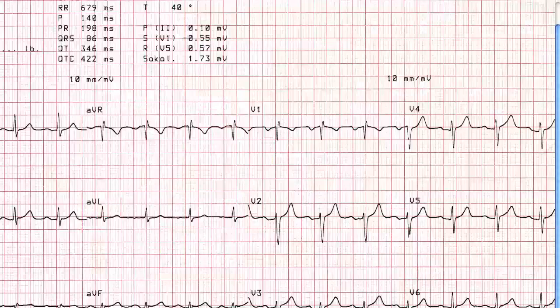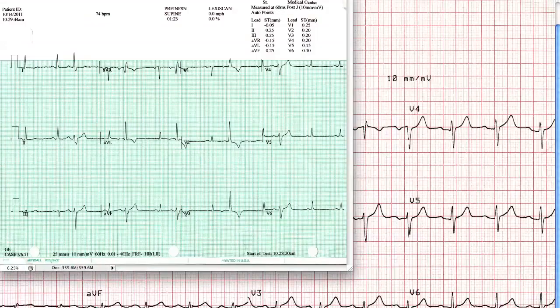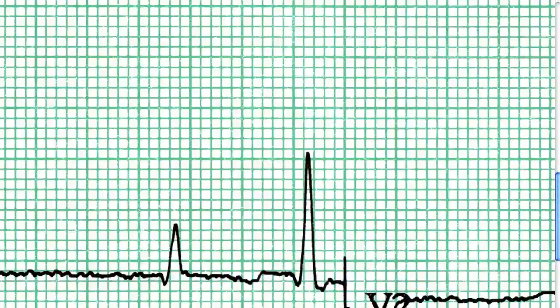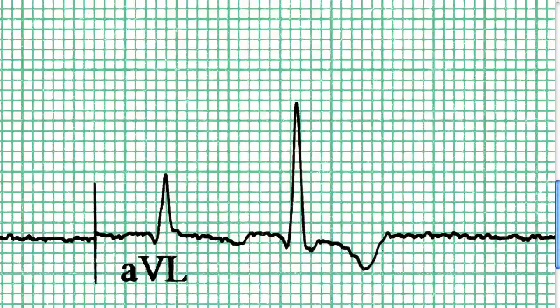Now, what I've shown you here is an ECG that was done on a typical rolling cart type of machine. This machine carries with it pre-printed paper. Now, the paper here has that pink box pattern printed on it, and either pens or another mechanism will imprint the ECG on there. This isn't the only type of ECG that you can see. There are other kinds of ECG machines that will use the color papers. You can see here you've got an imprinted green square checkerboard pattern with the ECG printed with black ink.